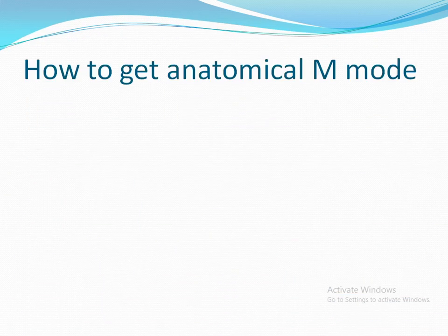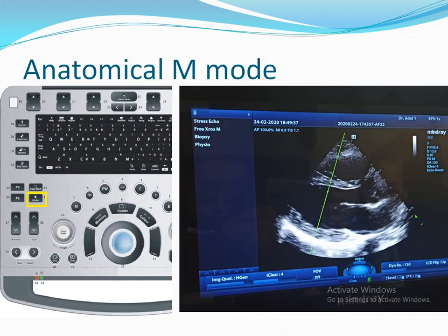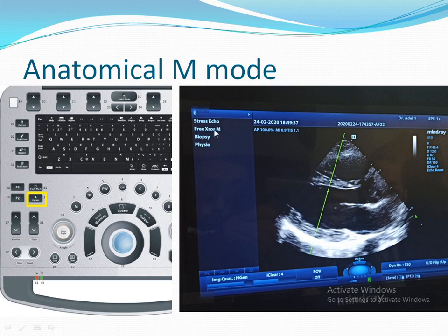How to get Anatomical M-mode: once you press M-mode, you will get a standard line on the screen. You will also have free angle controls on the screen. Press the Cursor button, then choose Free Angle M-mode. You can then change the angle of the M-mode line using the Angle button, or change the position of the line using the trackball.